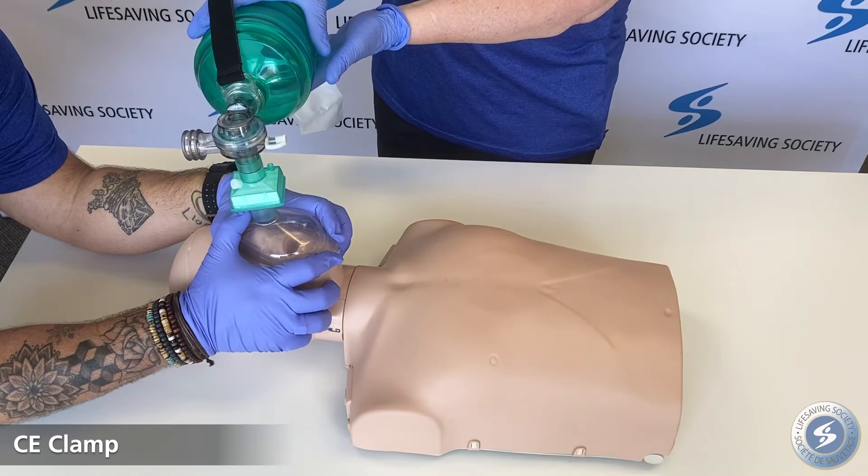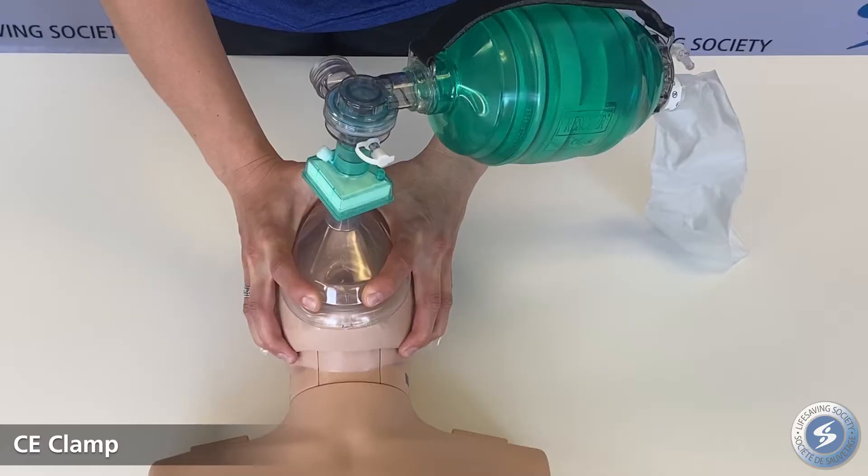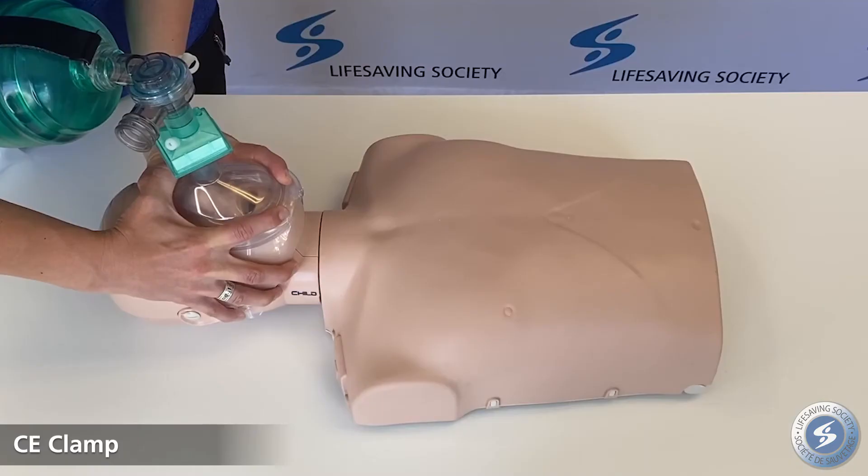For the CE clamp, the index finger and thumb create the C part of the clamp to seal the mask over the victim's mouth and nose. The rescuer's three remaining fingers create an E to lift the jaw and open the airway.